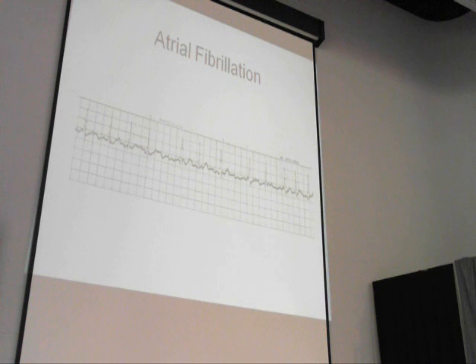And the AV node definitely is like, ain't no way we're going to explode. So what you'll see a lot of times on an EKG or on a chart is atrial fibrillation with a rapid ventricular response. Most of the time in atrial fibrillation, the person's pulse or heart rate is above 100, because the AV node is like terrorism taking over.